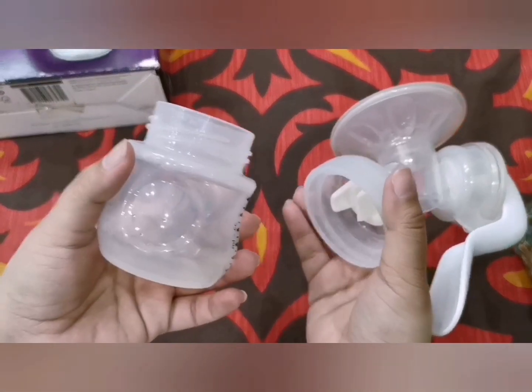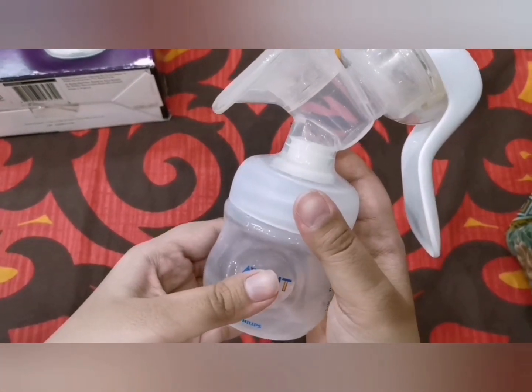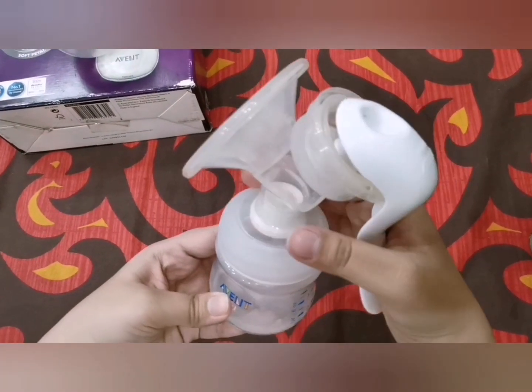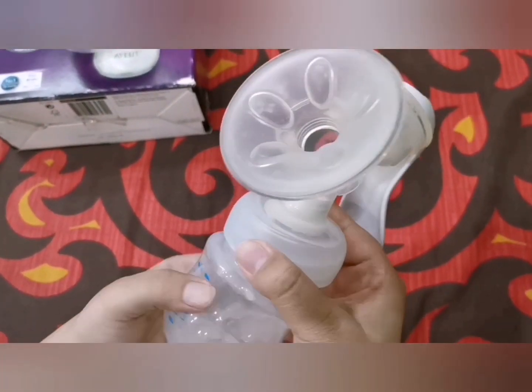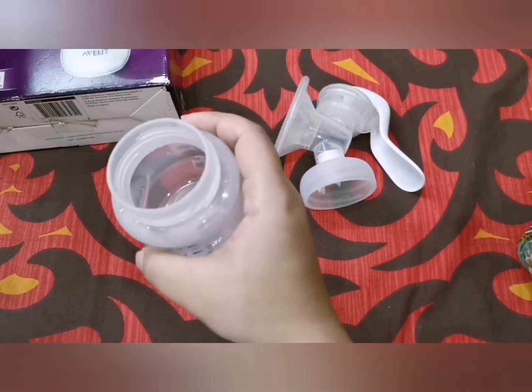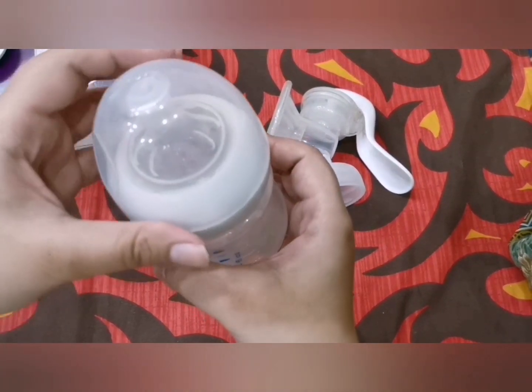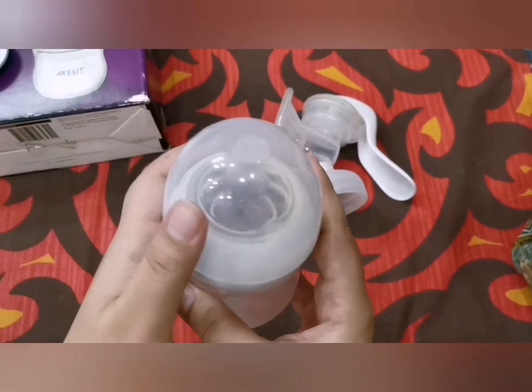If you routinely express more than four ounces, you can use the larger 250 ml or 330 ml Avent bottles. To use it, gently move the handle back and forth until let-down. After expressing, you can store the milk in the fridge using the sealing cap, or put the feeding cap on the bottle and feed the baby right away.